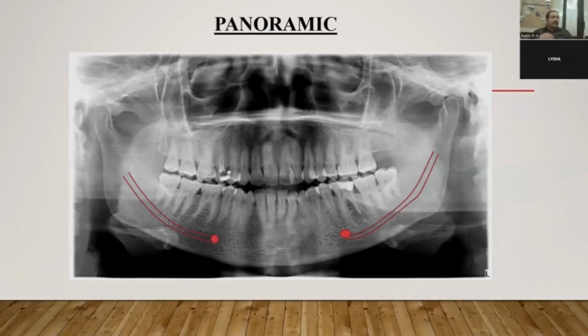So if you want to make a tooth-implant connected FPD, then make sure that you are not inserting too much pressure on the implant side. Less pressure will help with the crowbar principle, since lesser effort at one point will reflect as more effort on the resistance side. That balance should be maintained when you connect an implant to a tooth.